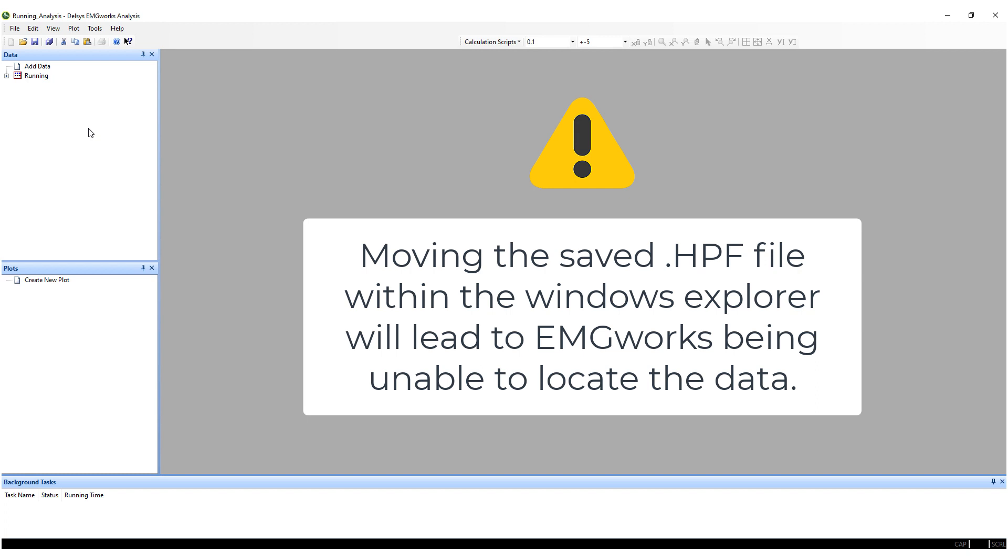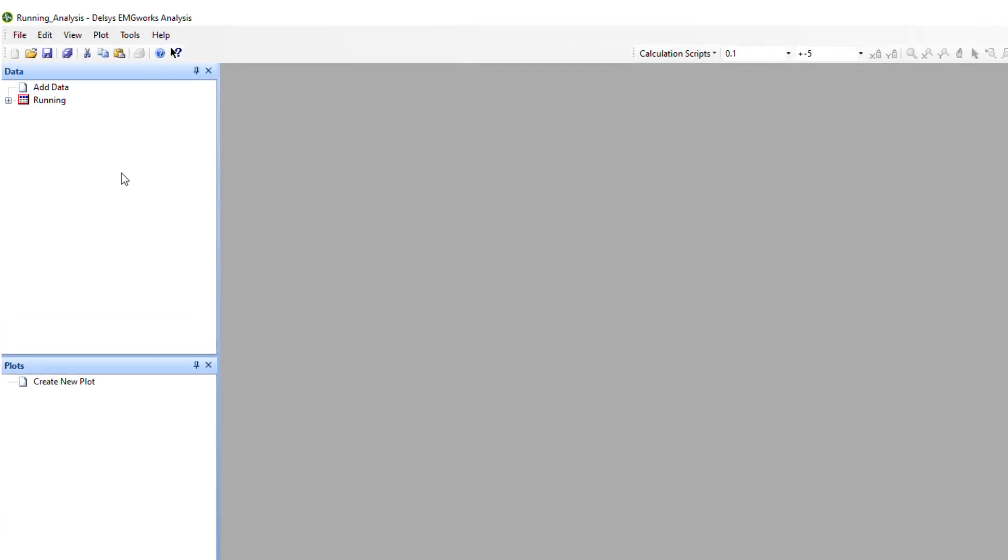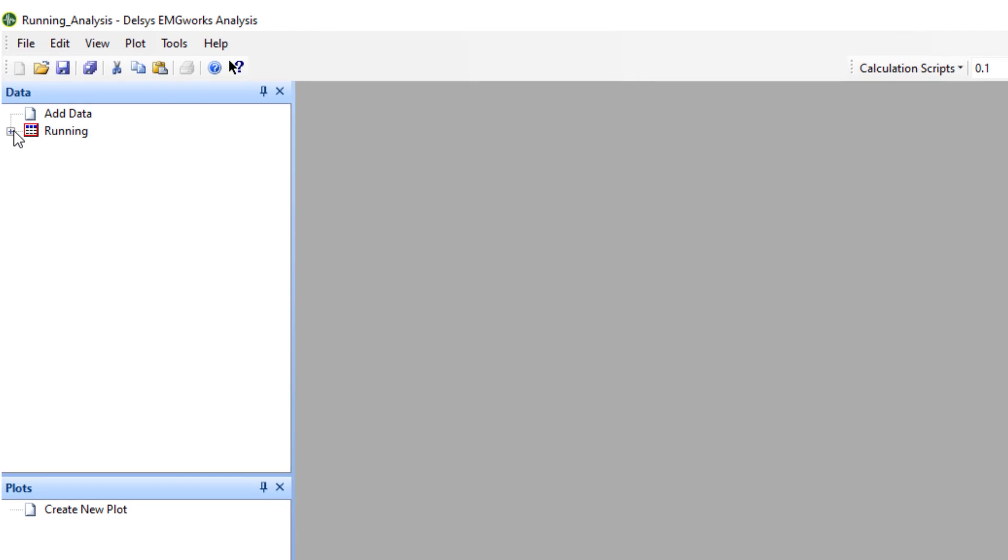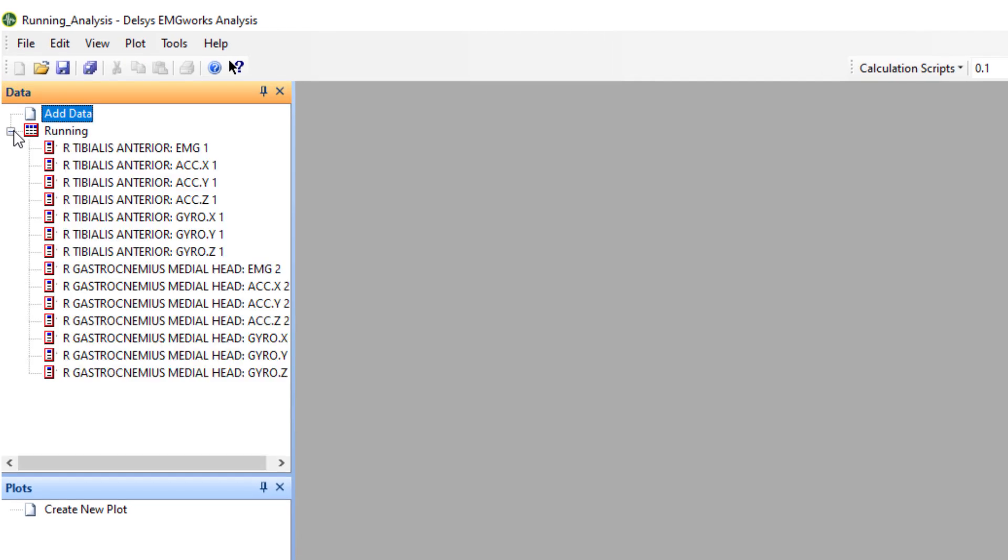EMG Works Analysis stores the saved file path. If you move the HPF file in the Windows File Explorer, the EMG Works Analysis will lose the path and be unable to locate the data. Within each data file, you will have data series, each containing a single channel of data from your recording.